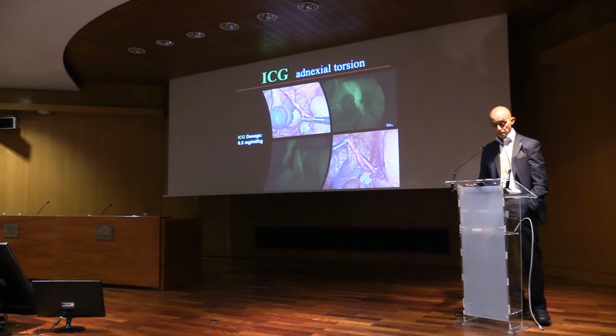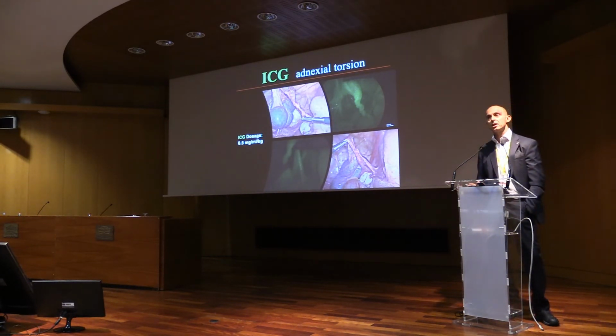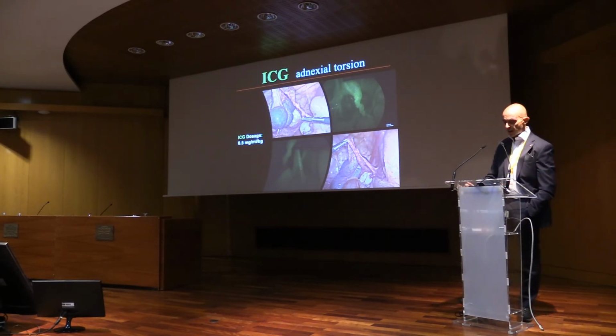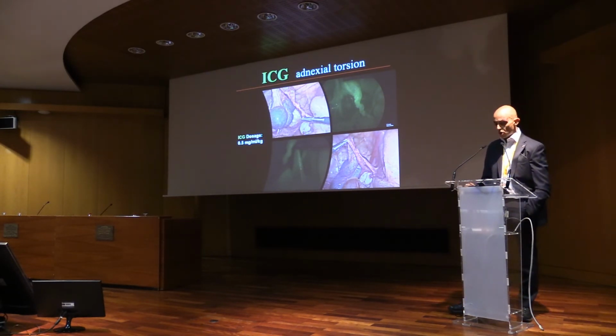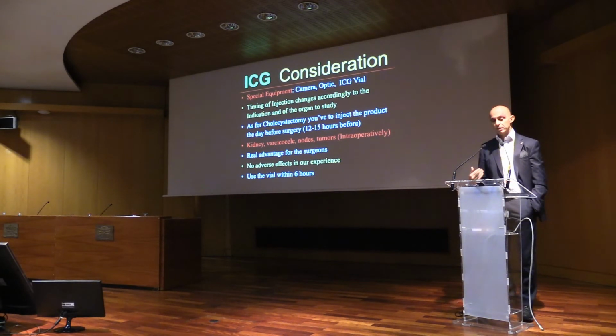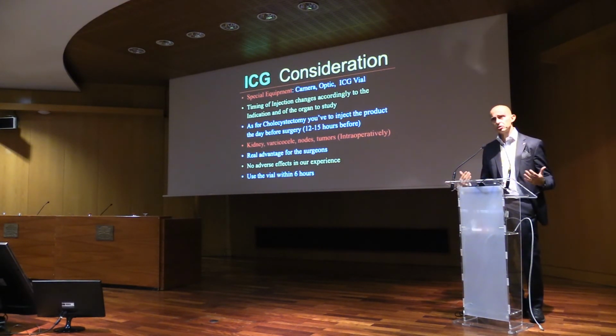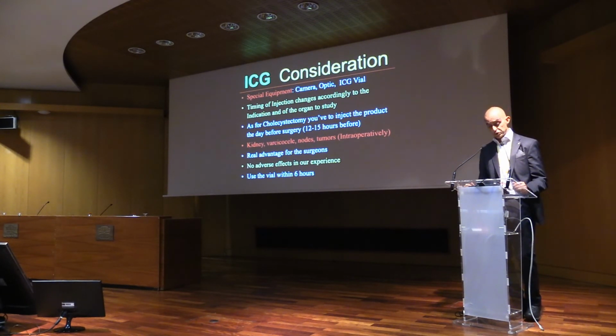Next. And then in case of adnexal torsion, before the rotation and after, you can check if there is a good vascularization of the ovary. Next. There are a lot of indications. I think the limit is only our fantasy, because we treat a lot of pathology from thorax, abdominal, GI, urology. For this reason, probably we will discover more indications in the next future.